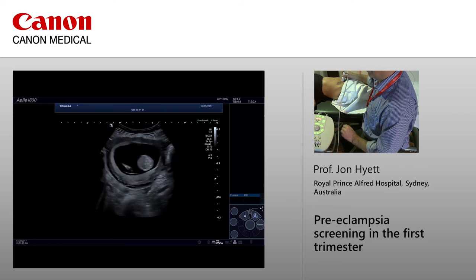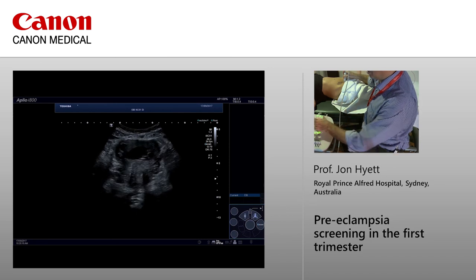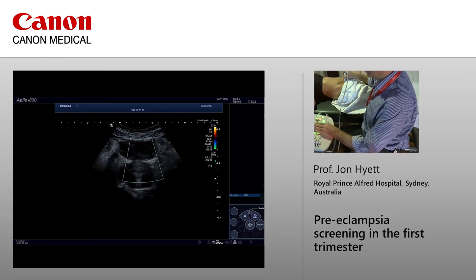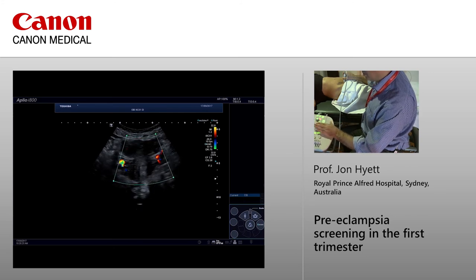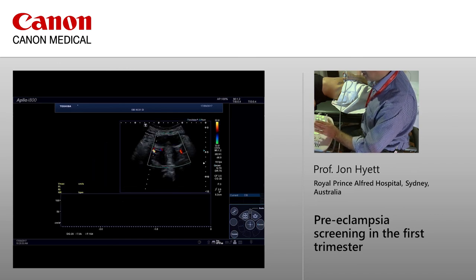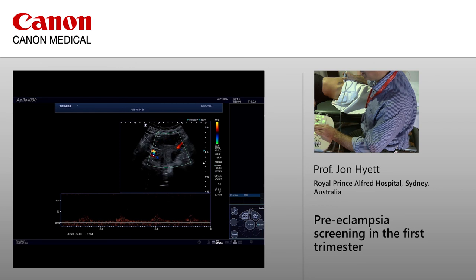And if I just come around to that transverse view, so you can see the fetus here, as I come down the uterus towards the level of the cervix, if I just put the color box on now at this level, then you can see the two uterine artery Dopplers. Probably just need to make the box a little bit wider, either side of the cervix there. And again, I think the nice thing about this is you have the reference of knowing where the other vessel is at the same time. We'd have to do a little bit of work just picking that up properly. And I'll just come across to the other side.